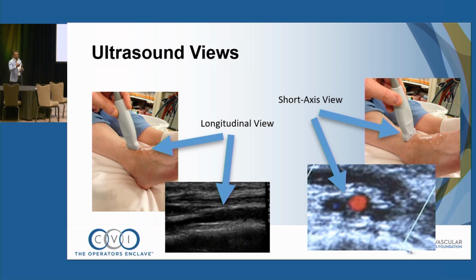And remember, with every artery, you're going to have 2 veins. If you don't see 2 veins with that artery, it's not a true pedal artery, it's a collateral. So that's how you'll know the difference. If you don't see 2 veins with the artery, that's a collateral branch that you're looking at, not the true pedal artery.